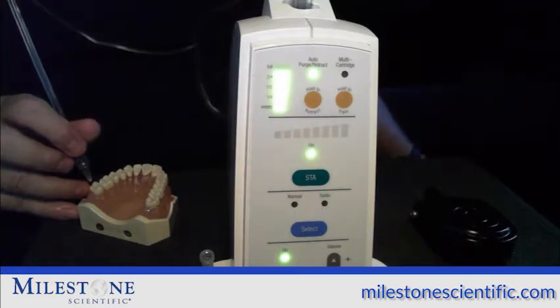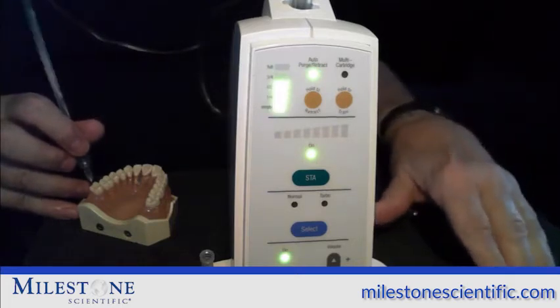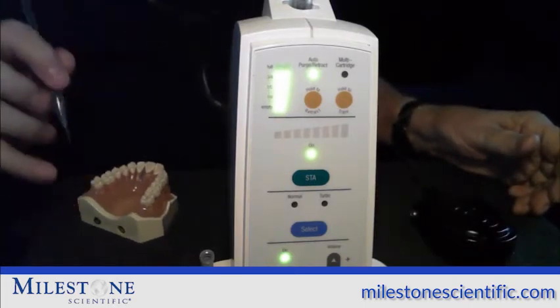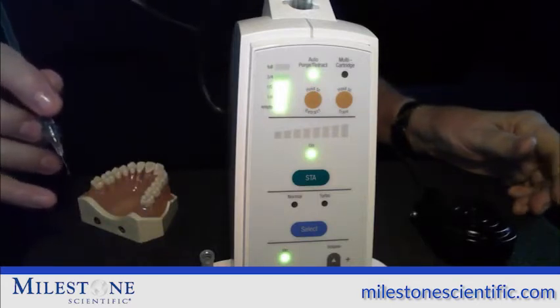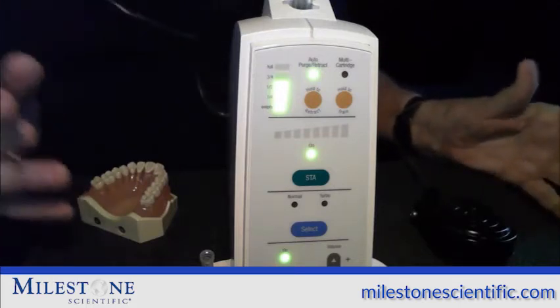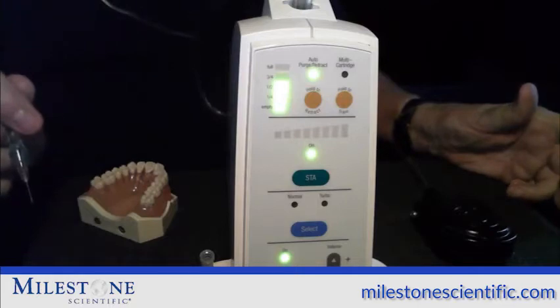When you want to take the needle out after you've delivered as much anesthetic as you desire in the proper spot, go into aspiration and during the middle of aspiration, after the third beep, take the needle directly out of the mouth. You should see one or two drops come out of that needle — that is perfect. But if you see a steady stream of anesthetic or 10, 20, 40 drops coming out of the needle after the aspiration ends, then that anesthetic did not go into the bone and you will probably not have sufficient anesthesia.